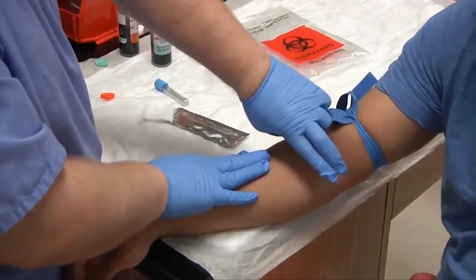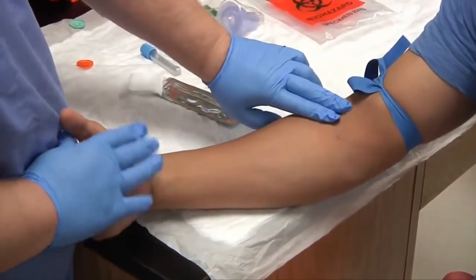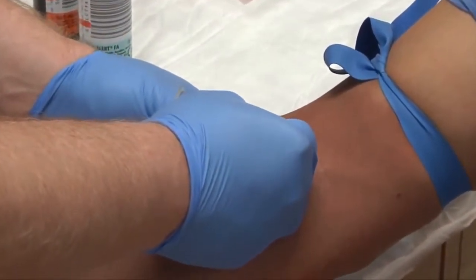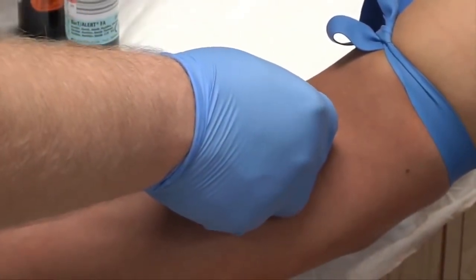And we'll want to go ahead and palpate our patient and apply our tourniquet. Go ahead and palpate with our two non-dominant fingers. You can ask your patient to make a fist if this helps you. All right, anchor your patient's vein. On the count of three, one, two, three. Have the blood flash.